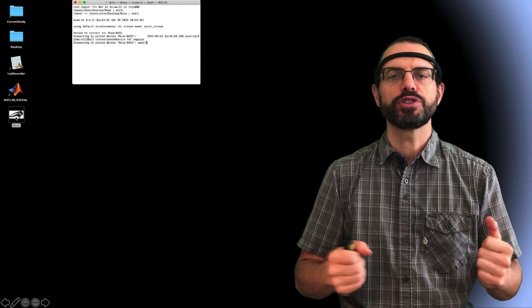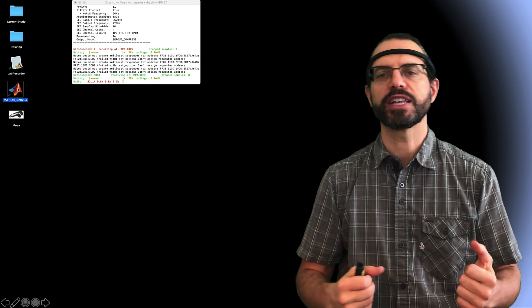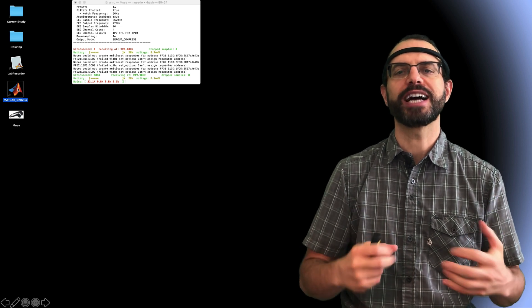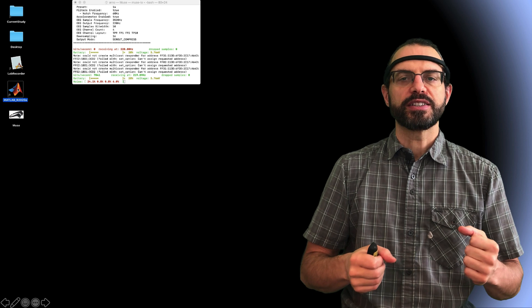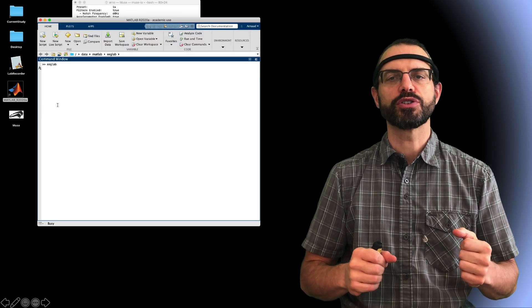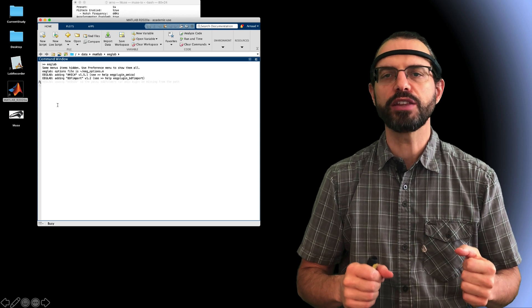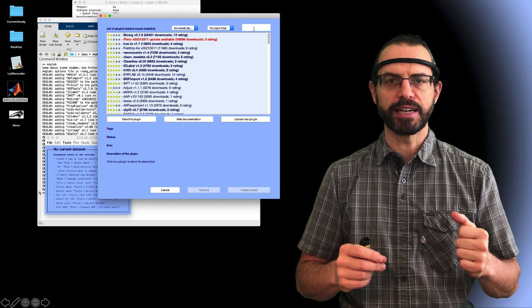Then I start the LSL software to connect to the Muse headset. Each EEG device and each device in general that can produce an event stream has its own software, often provided by the manufacturer. I then start MATLAB and EEGLAB and install the MATLAB Viewer Recorder plugin using the EEGLAB plugin manager. I search for LSL.